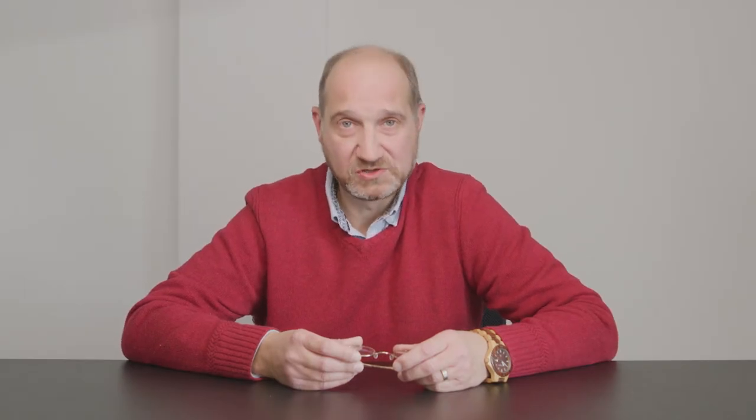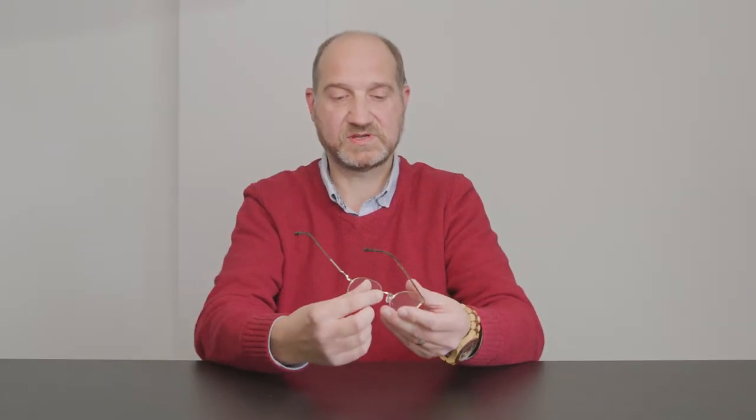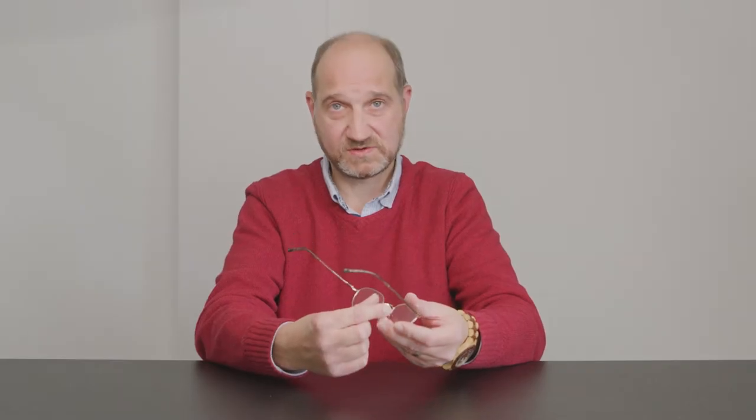Adjusting the nose pads is very easy and all the frames that we supply that have nose pads are designed to be adjusted. One of the reasons you might want to adjust your nose pads is if they're pressing on your nose and causing discomfort, or you find the frames are sitting a bit high. With the frame here, you've got the nose pads either side — these sit on your nose with a light pressure and support the glasses.